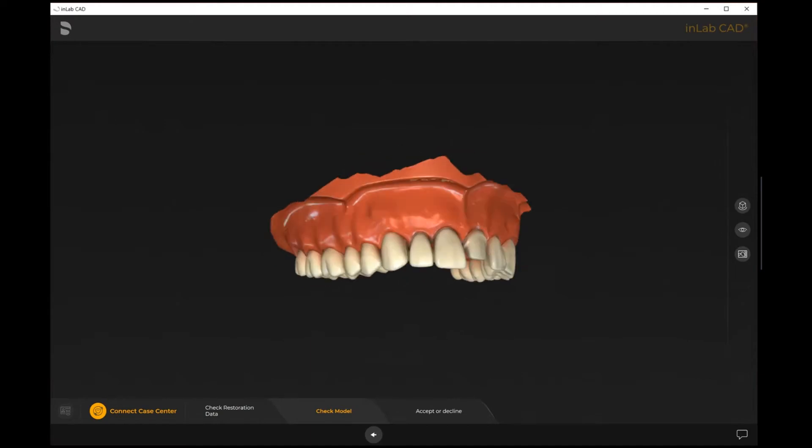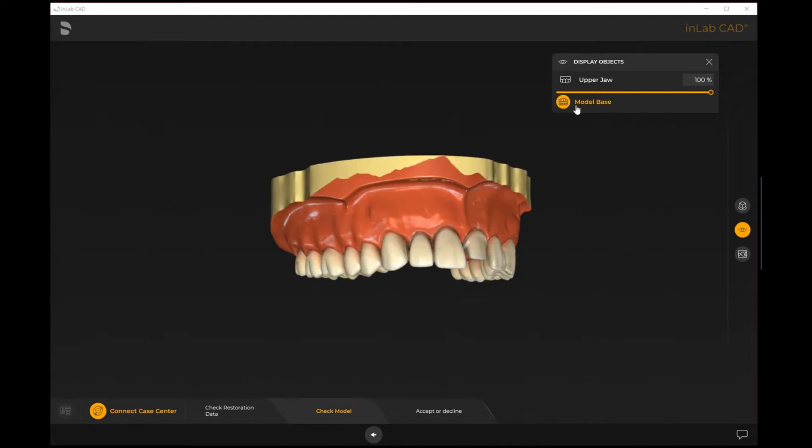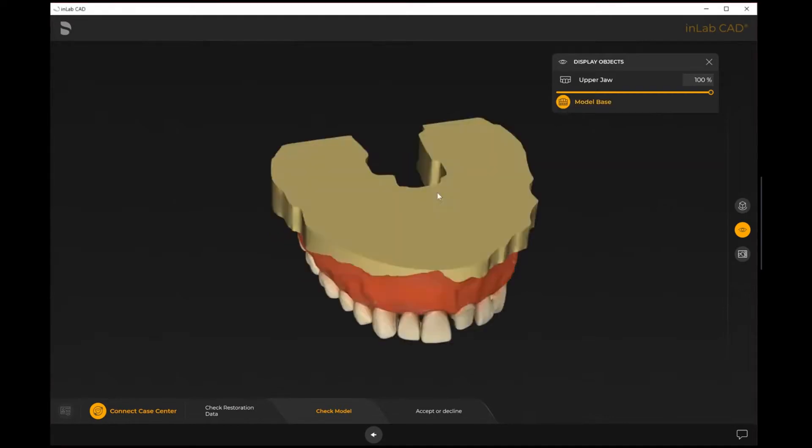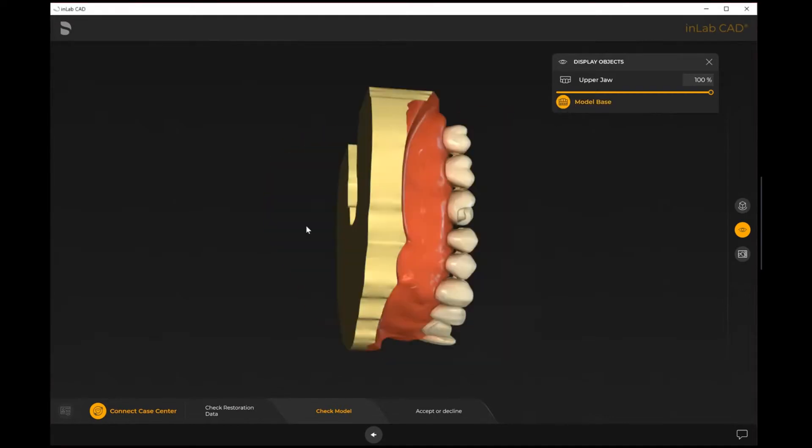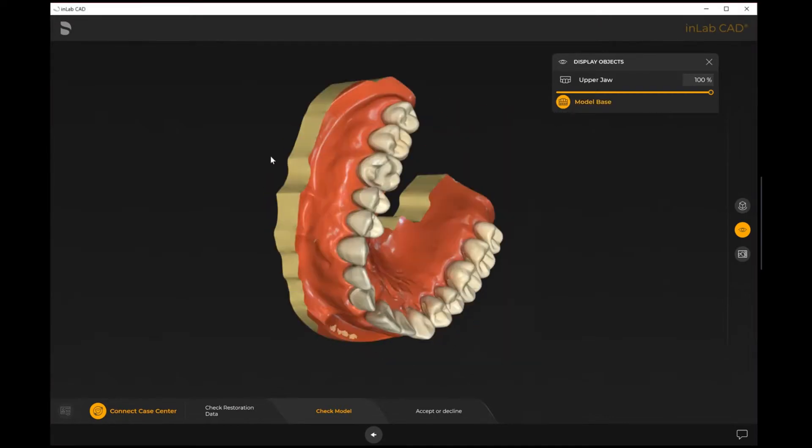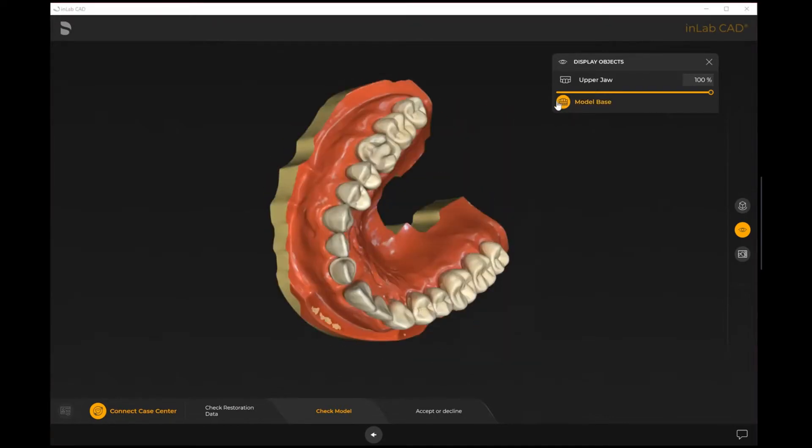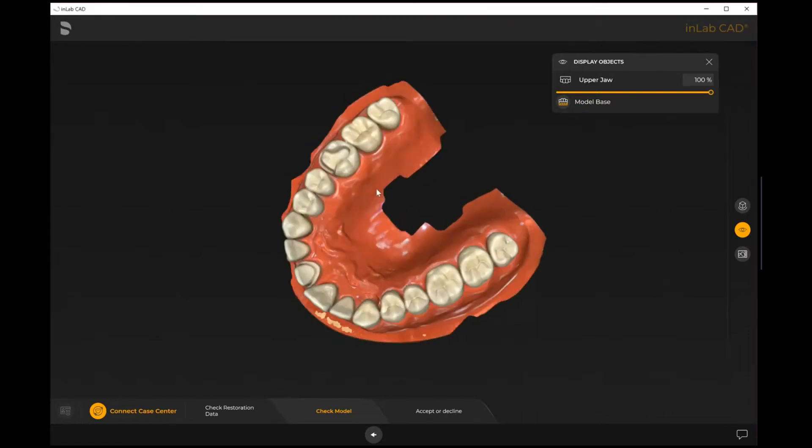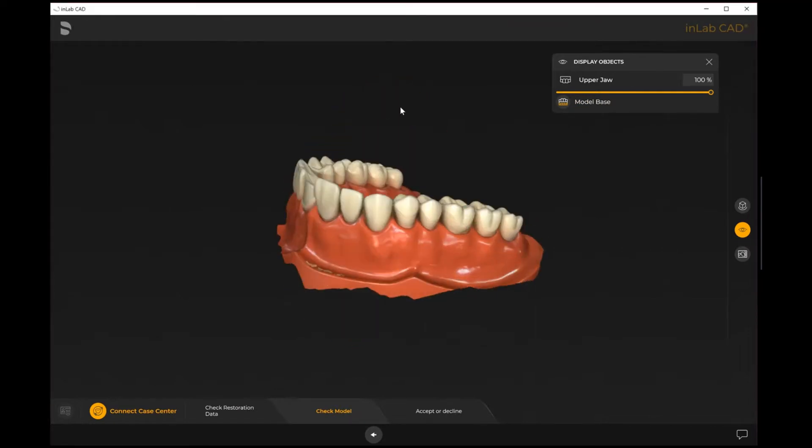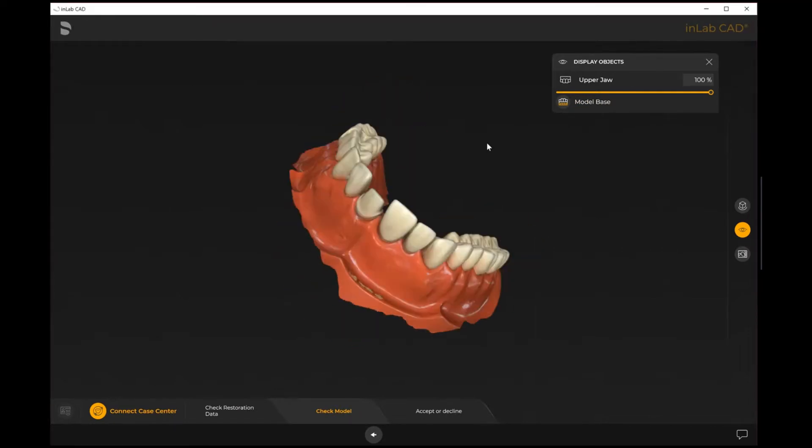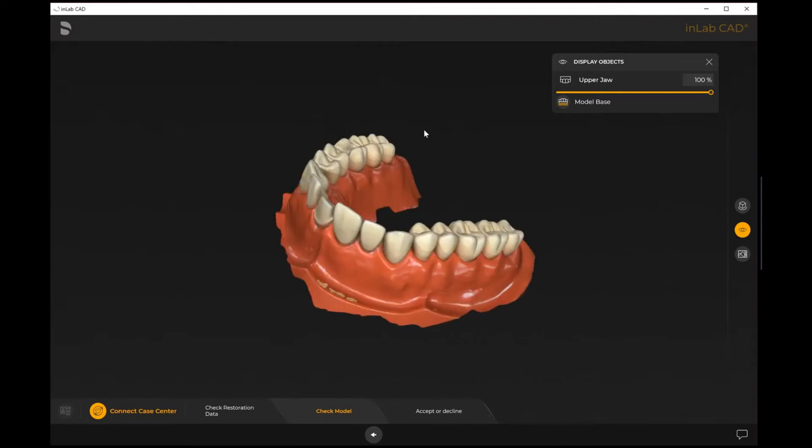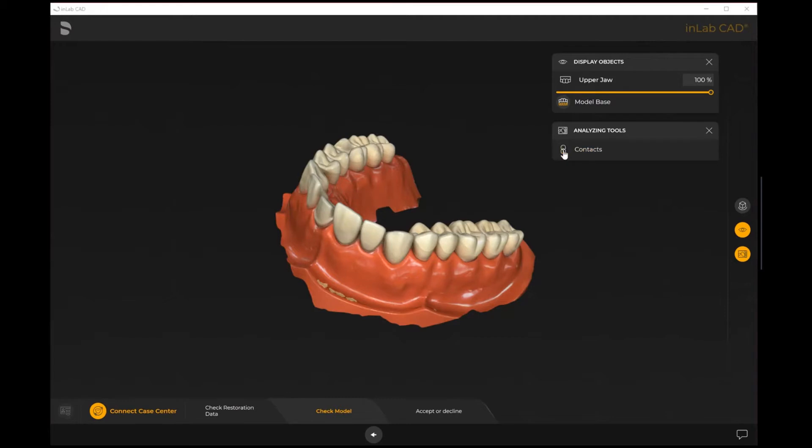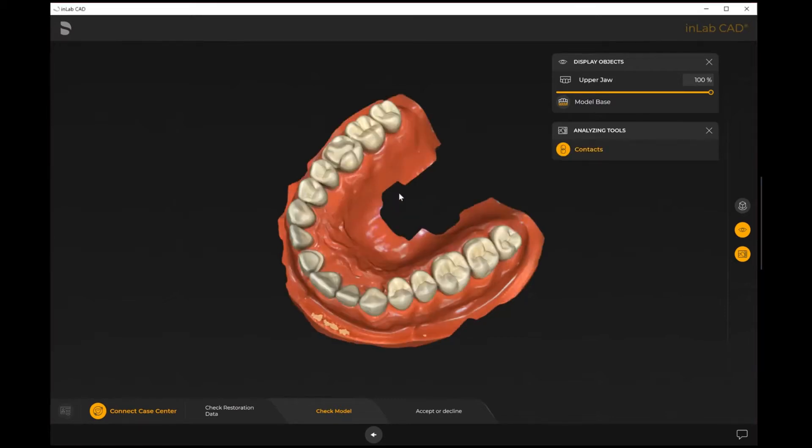We can turn on the model base if we prefer or remove that. Under display objects, in this particular demo case I've been just sent the upper scan. However, if there were additional objects, meaning additional scans, they'd all show up here so I'd be able to turn that on if needed. If this did have an opposing, I can turn on or off my contacts and they'll show up on the occlusal surface accordingly.